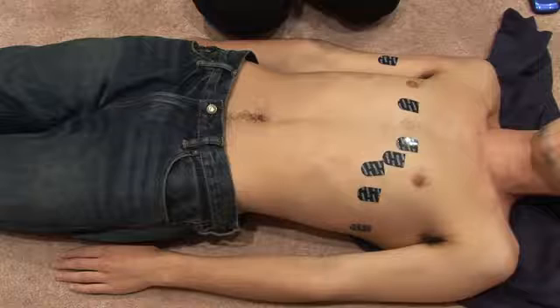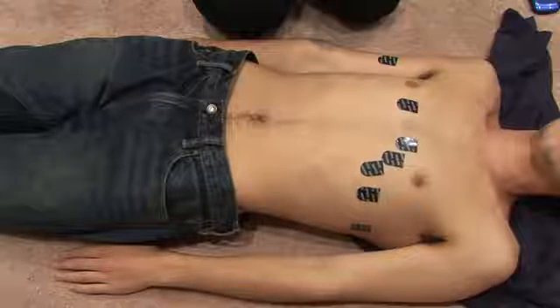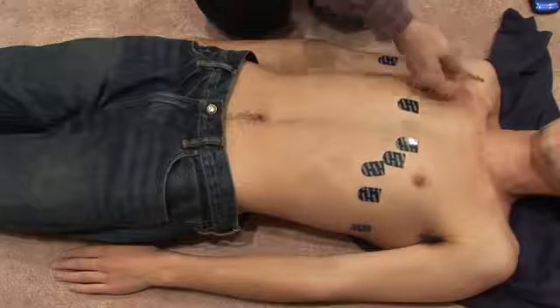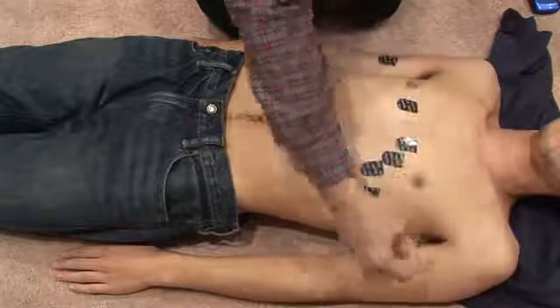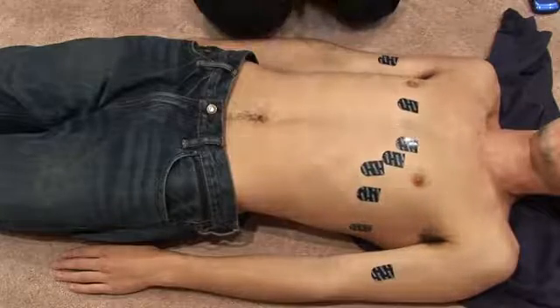Now, what about the arms? Well, the arms are easy. You want one on each arm. And you'll see some people in the ICU, they'll put their leads on the chest wall, but that's usually not the best place to put it. If you're doing a formal 12 lead, you should put it on the arm.